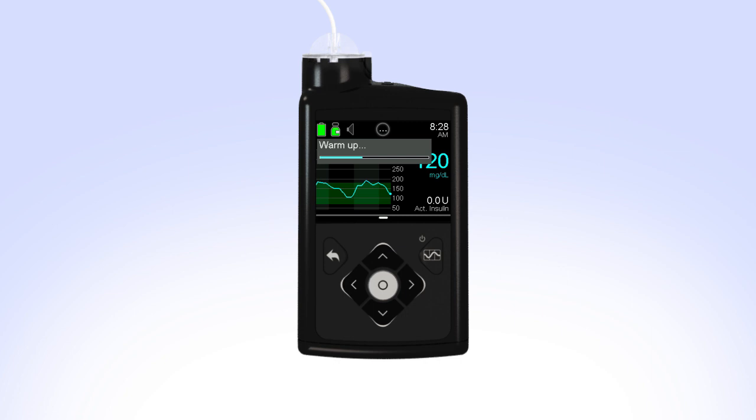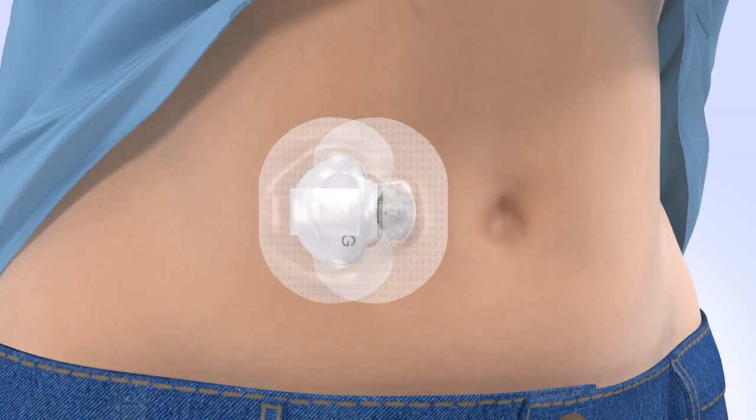Note: if 15 minutes have passed and the warm-up bar does not appear or it looks like it is not progressing, look in the Quick Status screen. If you see the time of Next Cal listed, the sensor is in warm-up. Your pump will notify you with a Calibrate Now alert when it is ready for its first calibration. As you wear your sensor, be sure to regularly check your site. If additional tape is needed to secure the sensor and transmitter, you can apply off-the-shelf tape.